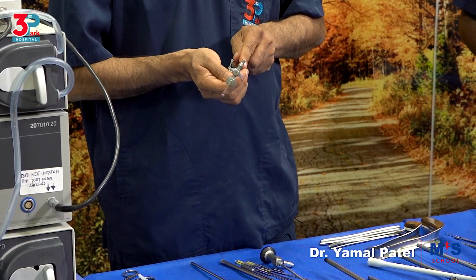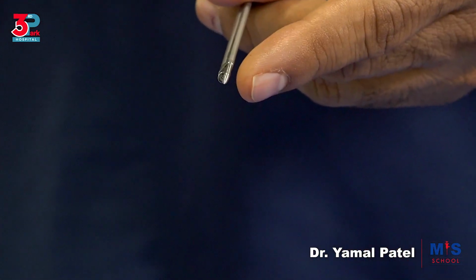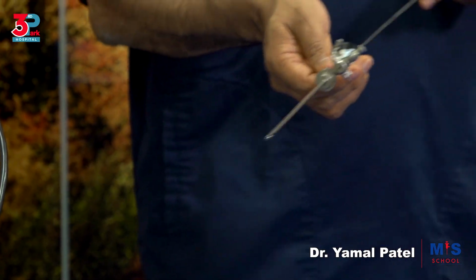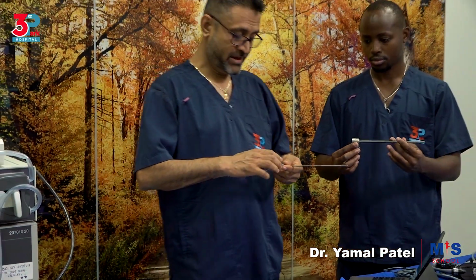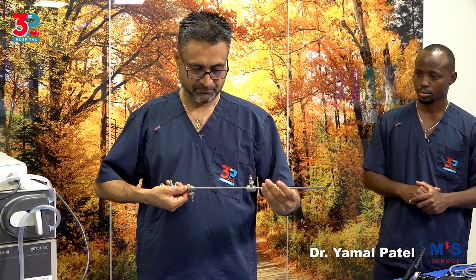So you can see where the instrument will come out from. The instrument comes out where the fluid goes in from, so they share the same channel in this inner sheath. So we have the inner sheath with two channels, the outer sheath with fenestrations and one channel. And when these are connected, what is important is it becomes a 3-channel hysteroscope.